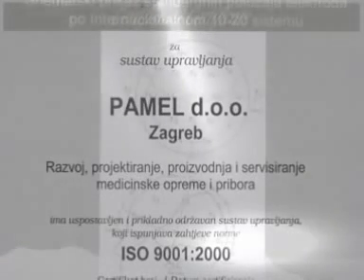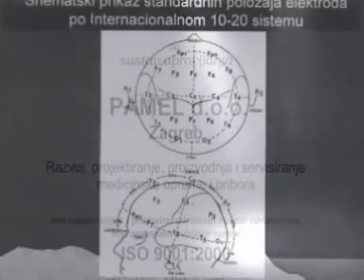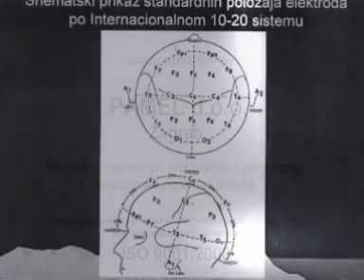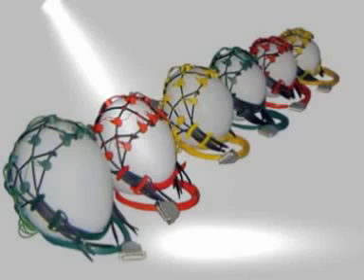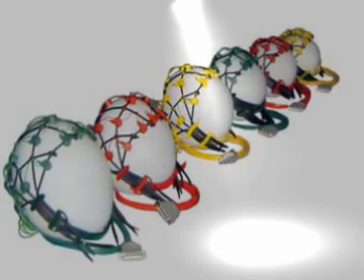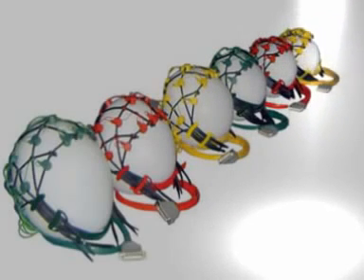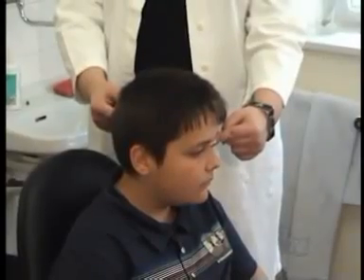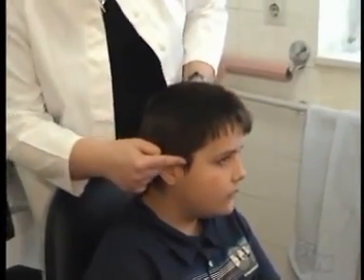The best way to start the educational part of this presentation is with the International 1020 system. This is a schematic view of the International 1020 system. COMBY EEG caps are made in 6 different sizes, 3 child sizes plus 1 cap with 10 electrodes and 3 adult sizes. The referential spots are nasion and inion, and the left and right preauricular pits. The intersection of these two lines is the vertex.